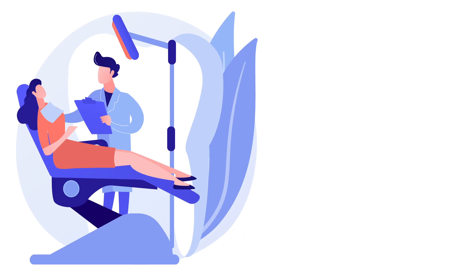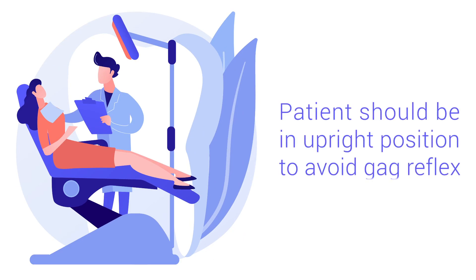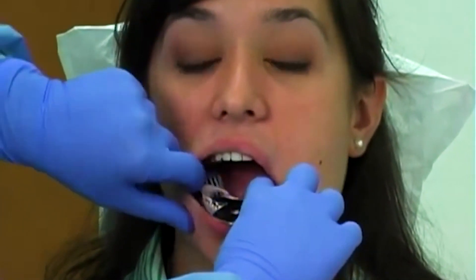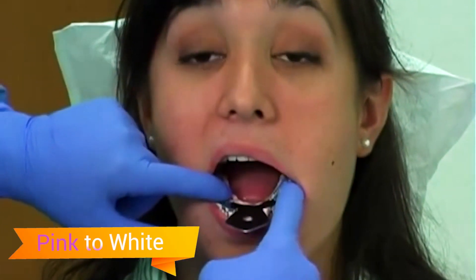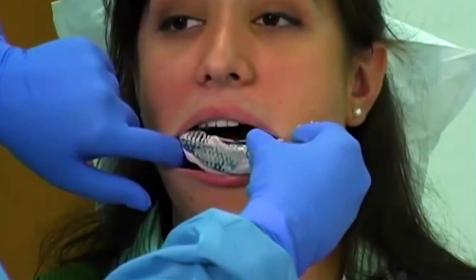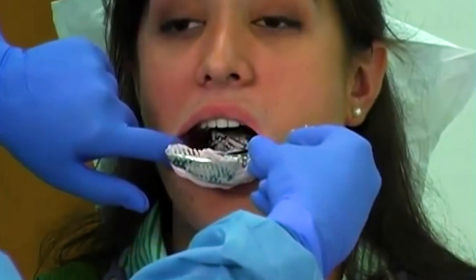Educate the patient about the impression procedure and ensure the patient is sitting in an upright position to avoid gag reflex. Place the tray in the patient's mouth and make the required facial muscle movements to record the impression. The impression will change color indicating it is set properly. Carefully remove it from the patient's mouth by gently wiggling the tray.